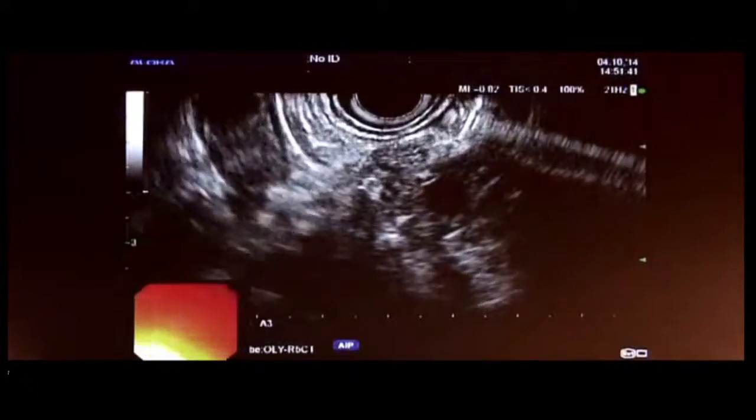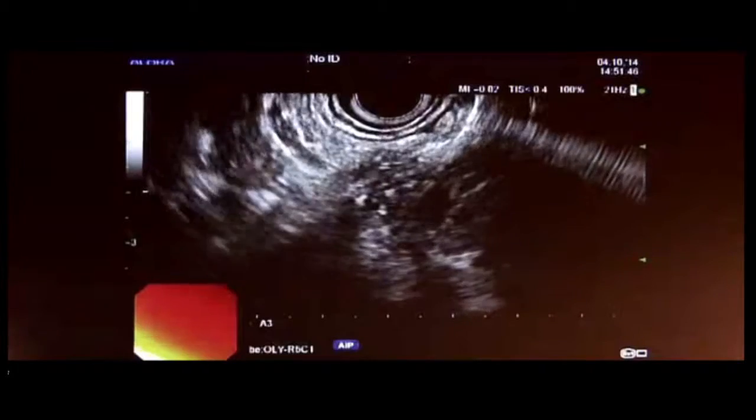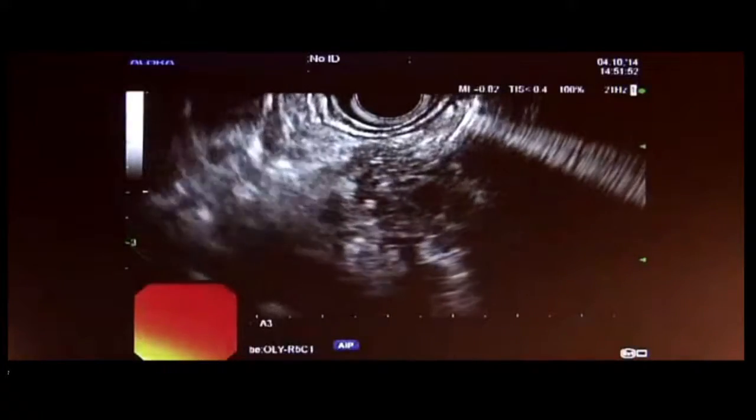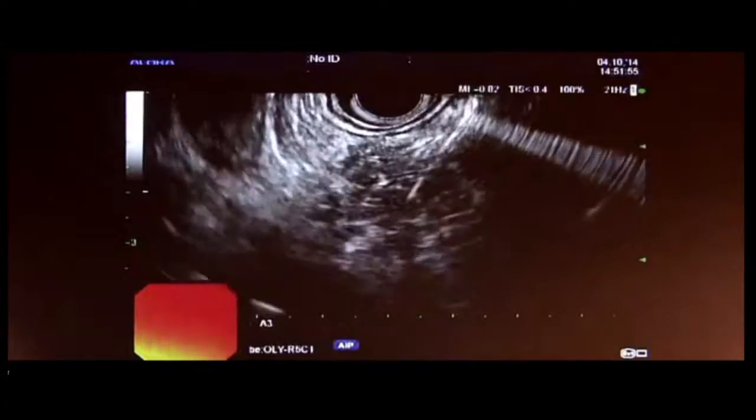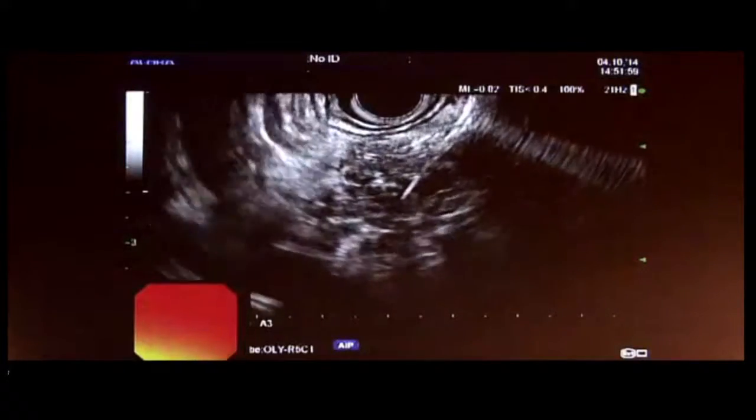Okay, I'm going to look again and what happened? Okay, so now I'm in something, but I have to look and see whether the tip is where I want it. I need someone to continue to hold this. If you don't mind just holding it for another second.